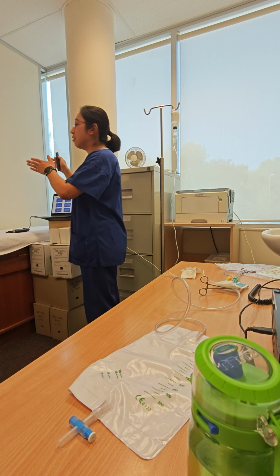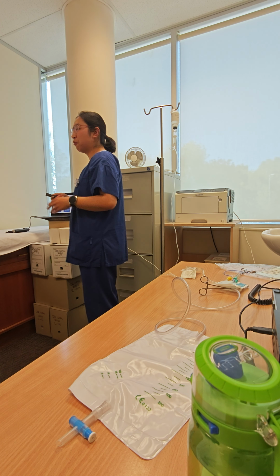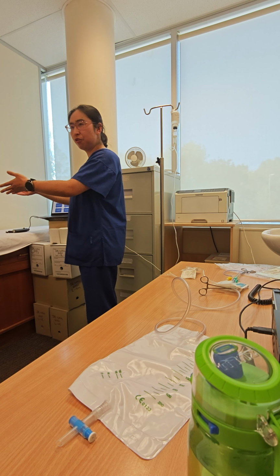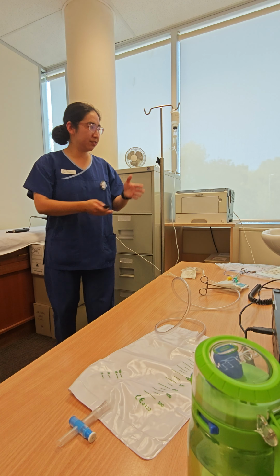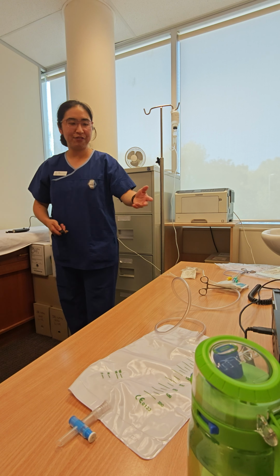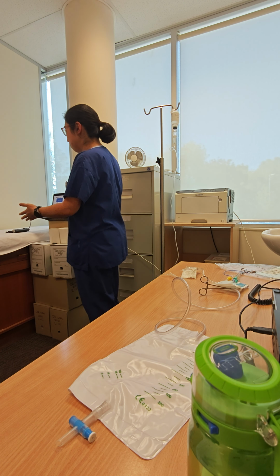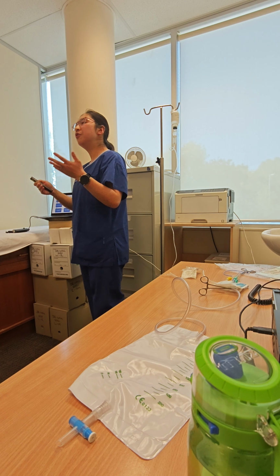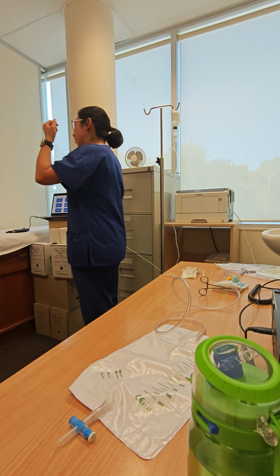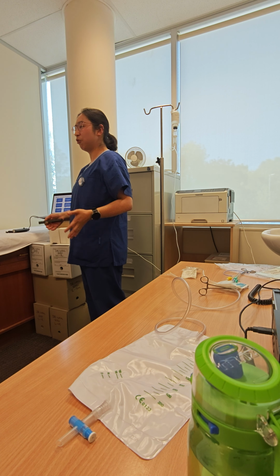So when the doctor comes back to the room, they're ready, they put the gown on, everything is ready. We're gonna introduce our doctor to our patient. That's our doctor's job now. And he's gonna start to inject the contrast and ask, do you feel full? I feel full, okay. They're gonna stop here and they're gonna come back to have some pictures. Usually doctors prefer to have supine first, then left oblique, right oblique. Yeah, if he is happy, he's gonna say, oh, well, okay, well done.